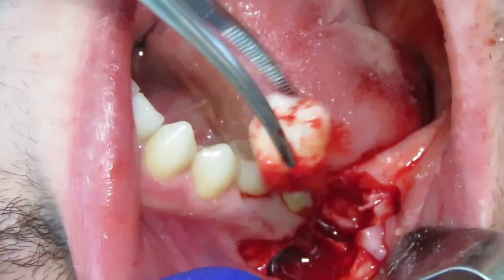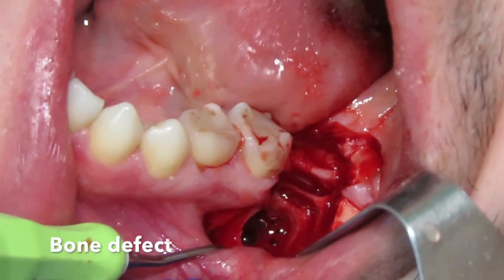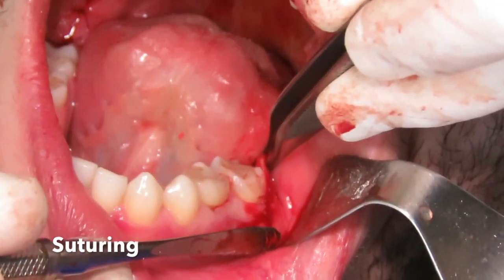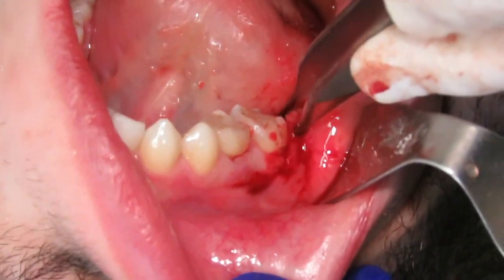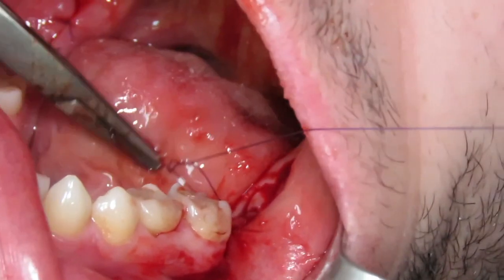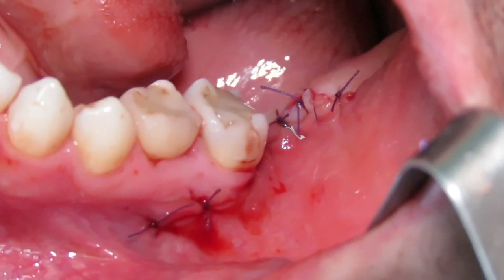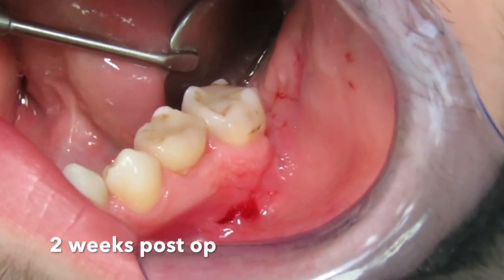The site is curated from any remnants from the pericoronal cyst, and then flap is released and sutured in place. This is the site sutured following the surgery and the healing 2 weeks post-operatively.